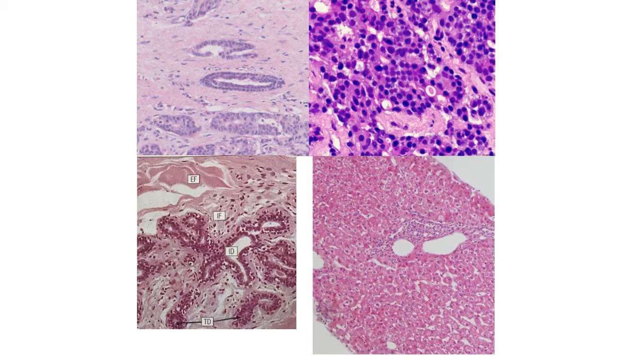There's dense fibrous tissue. Lymphocytes and fibroblasts can be seen. So the lymphocytes here, which are the body's way of fighting abnormal cells, and fibroblasts down here, which have a slightly different shape. They're more elongated.